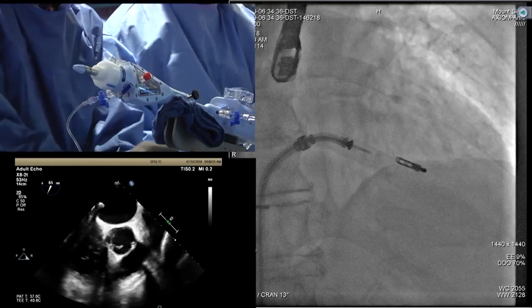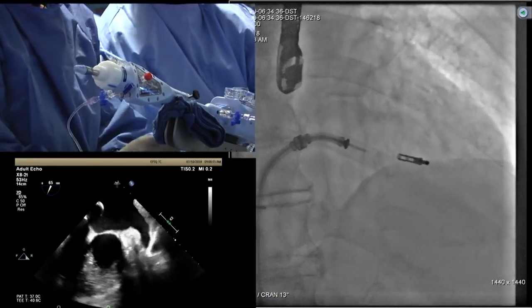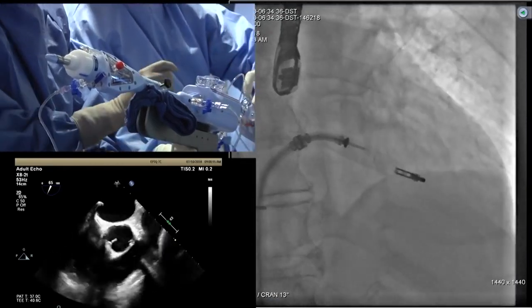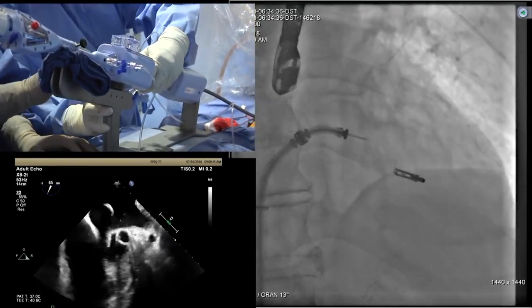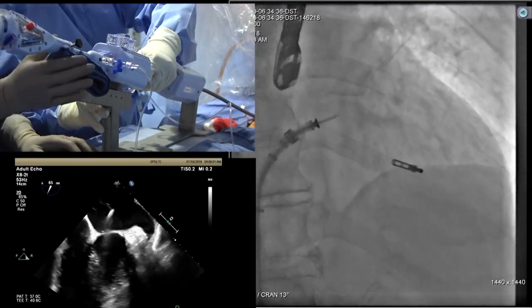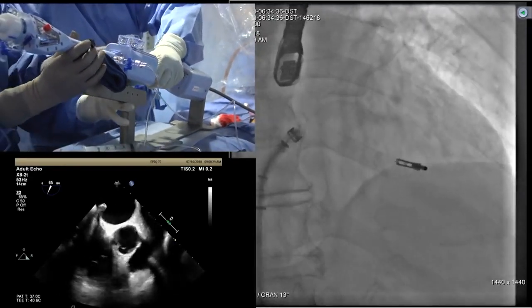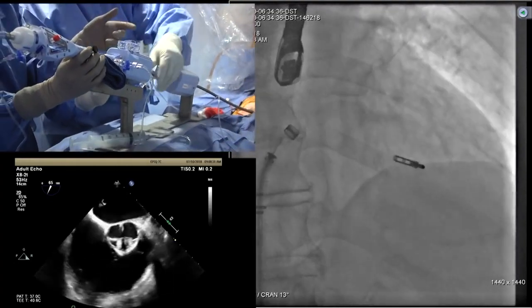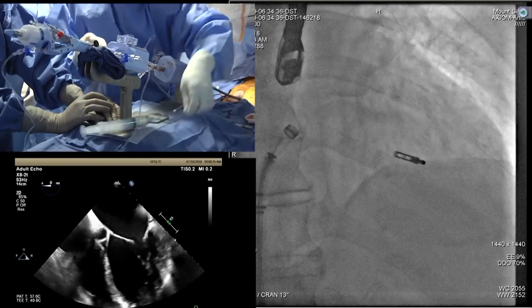Okay. Take the M knob out. So what you have to do, undo everything that we did. We had a lot of M. Undo the M, take out the plus. Yes, good. So what essentially we did, we had plus, we had M. We undid all of that and pulled the clip delivery system in the guide.